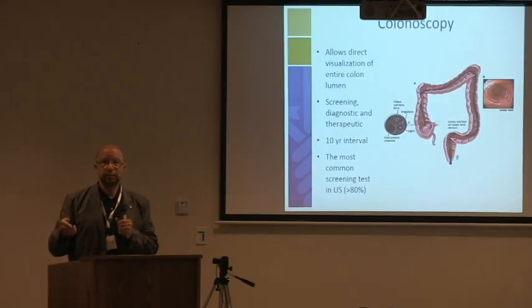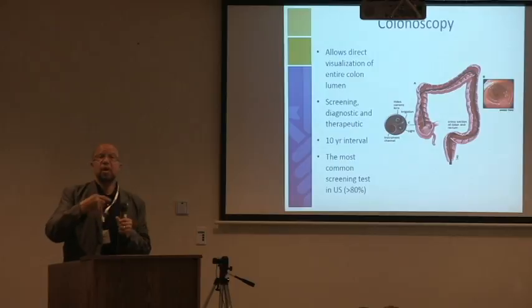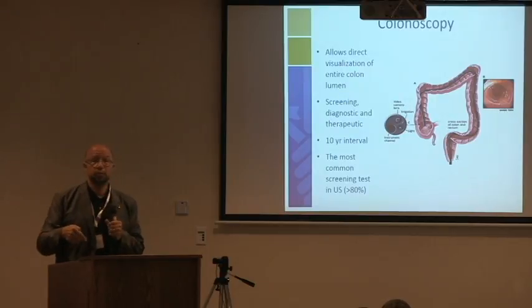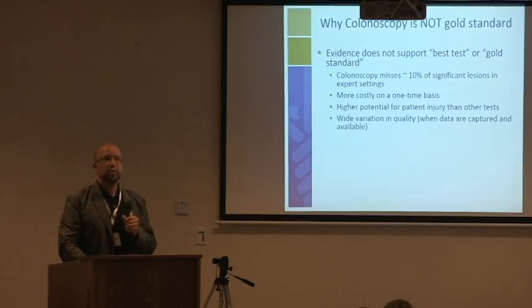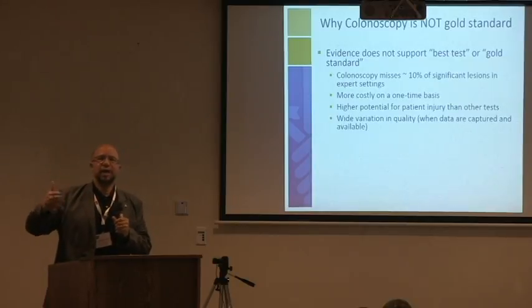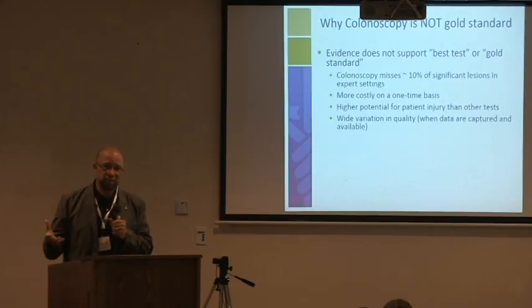What's not to like? Well, unfortunately, there are some. Now, because of those features, it has become by far the most common screening test used in the U.S. and probably accounts for 85% or more of the screening that takes place. But it is often referred to as the gold standard, and that kind of makes me grit my teeth a little bit when I hear it, because gold standard implies a level of perfection that frankly colonoscopy has not achieved.